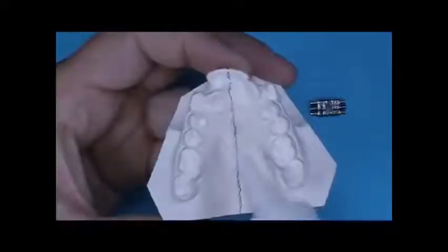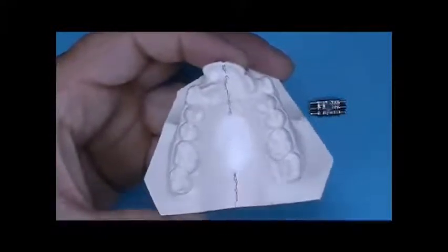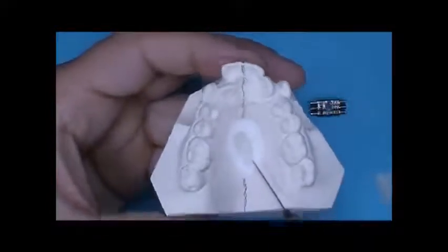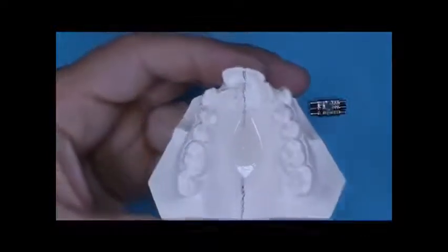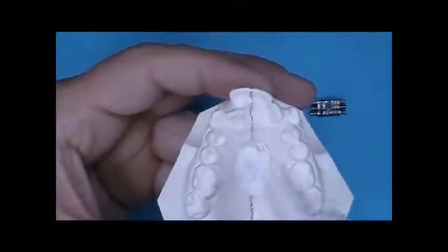Using the salt and pepper technique, the resin is applied to the center of the palate. Apply layers of polymer powder and monomer liquid to build up foundation that will hold screw position. The higher the screw is suspended off base of palate, the more resin will be needed. Make sure screw is at least 1mm away from palatal tissue.